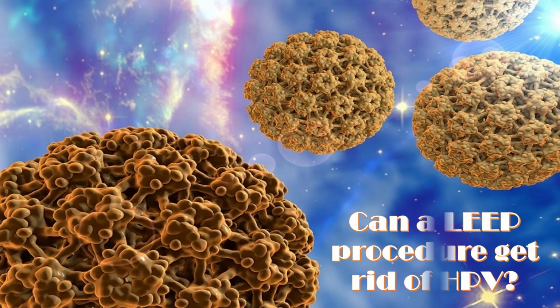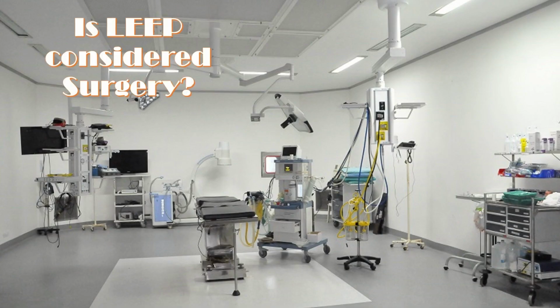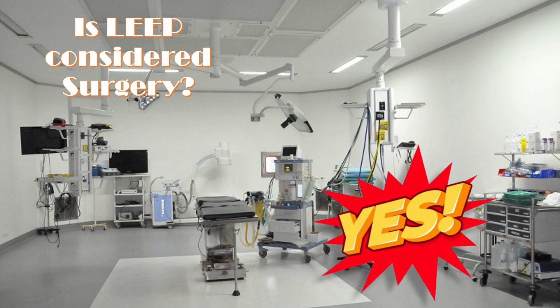Can LEEP procedure get rid of HPV? The answer is no, but a LEEP can get rid of abnormal cells that form in response to HPV infection so that they never become cervical cancer. Is LEEP considered surgery? The answer is yes. LEEP is a kind of surgery, but unlike other types of surgeries that involve sharp instruments, LEEP uses electricity to cut and remove the tissue.